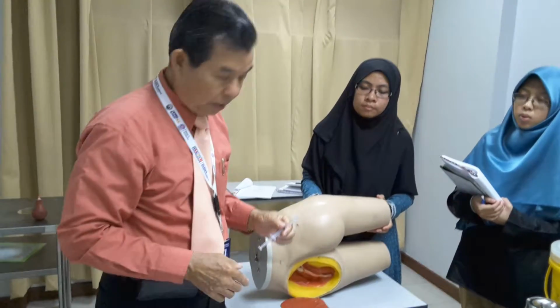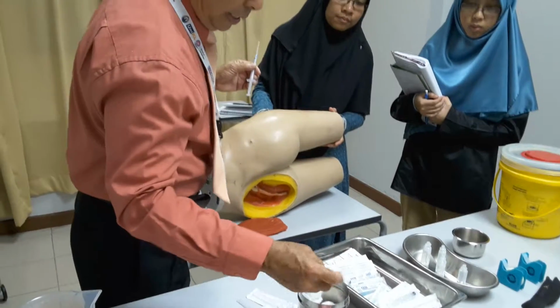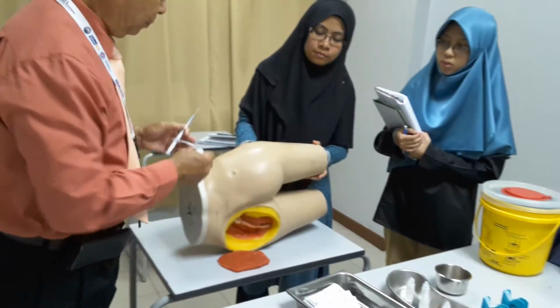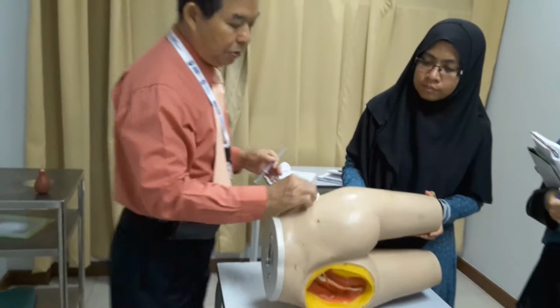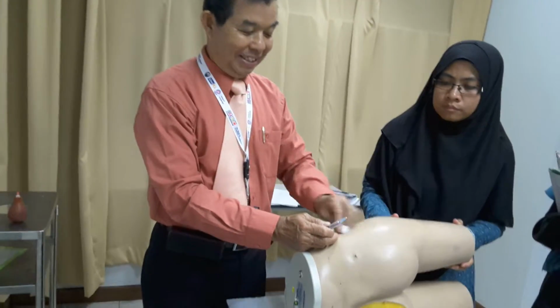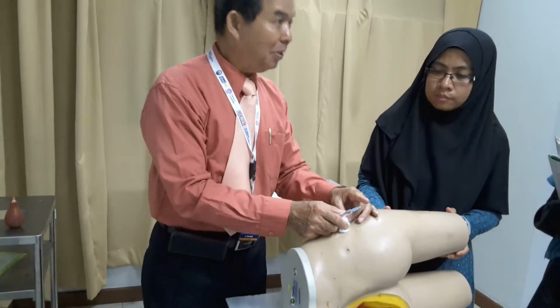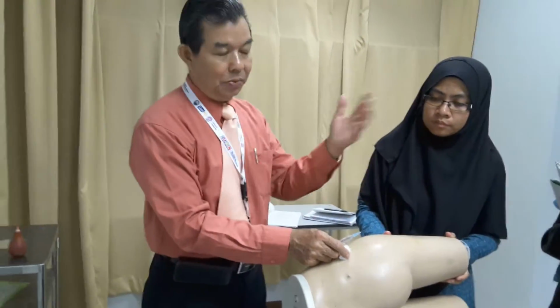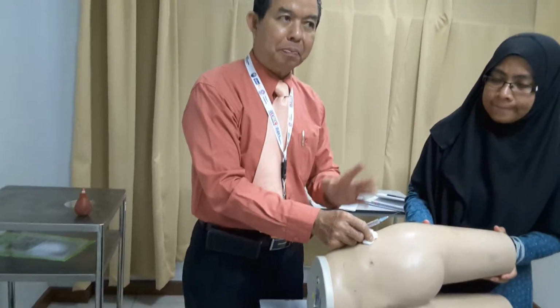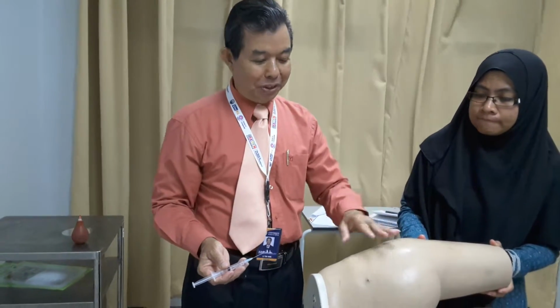Now you are going to inject. So I'm going to take the spirit swab. Assuming that this is the swab, here I'm going to swab. And the patient, I'm going to inject. Like other times, all the six steps: introduce yourself, greeting, whatever. Now after six steps, there may be a little bit of discomfort, a little bit of pain. Don't worry, I'll be very gentle. And the way I inject, there may not be pain. That is my usual way of routine.